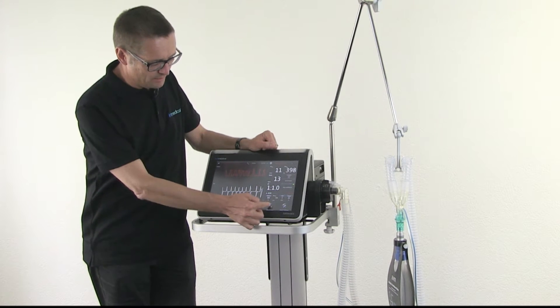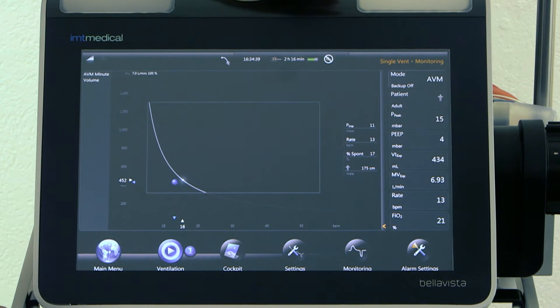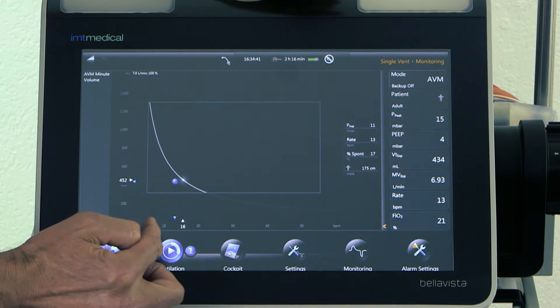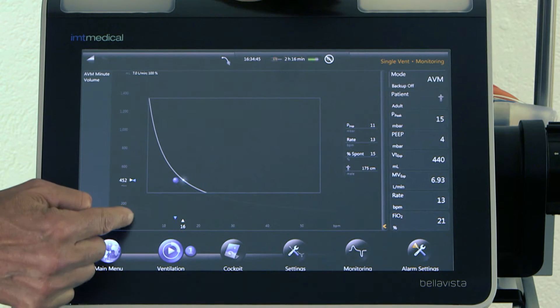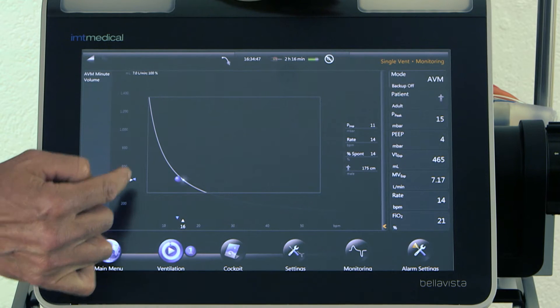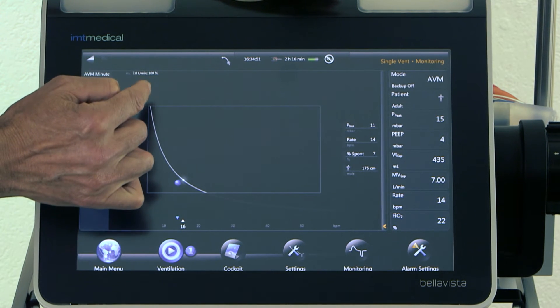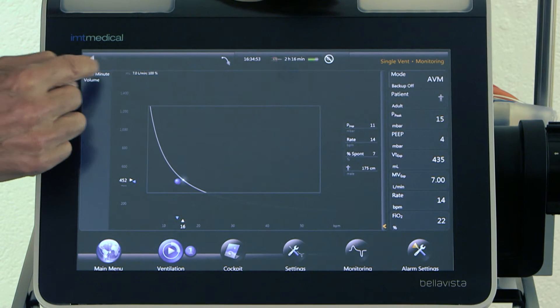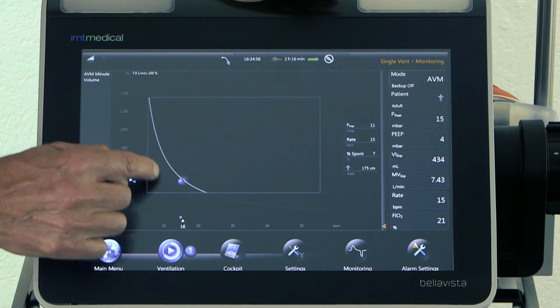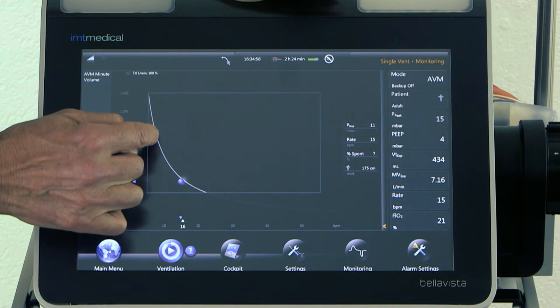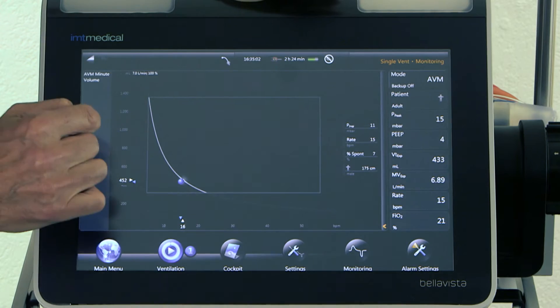We can have another look at this as well — it's called the AVM graphic. On the horizontal we see the rate, and on the vertical we see the tidal volume. This line here is the minute volume of 7 liters per minute we have just set. So 7 liters per minute can be achieved with a very low rate and high tidal volume, or a high rate and a low tidal volume.